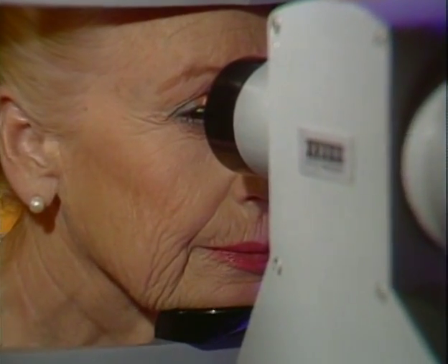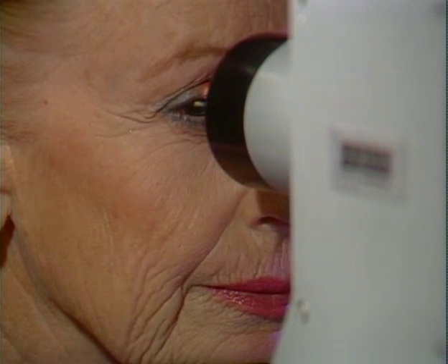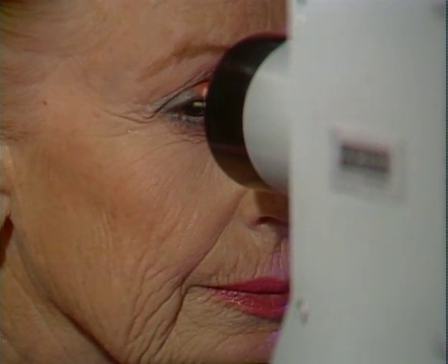Some people feel nauseated for a moment when the dye is injected. The dye may make your skin look yellow or urine orange, but these effects are only temporary.